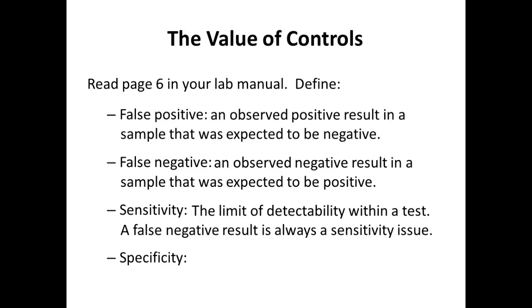So that's the limit of sensitivity. You have to have enough of the hormone to be able to get that positive result that you expect when you're pregnant. Make sense? Okay. So again, that's a sensitivity issue where sometimes you'll get false negatives, where in fact you are what that test should be testing for. You're in fact pregnant. Now the flip side: if it comes out positive, don't take 3 or 4 or 6 more tests like Juno did.